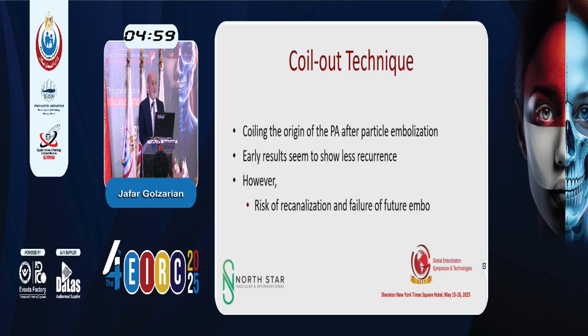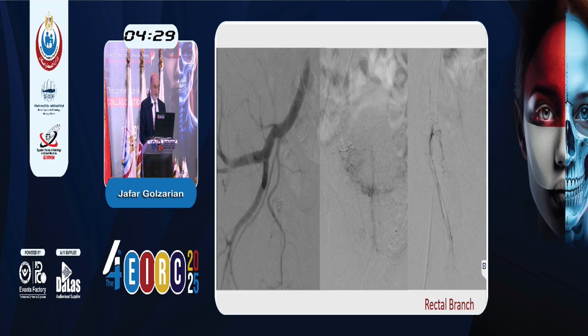The coil-out technique was proposed by Ari Fishman, and we started to do that at the university, and the goal was to prevent the vessel from reopening. I don't say it's a bad thing to do, it's just you have to be very careful when you do that. You have to pack exceptionally well, because if you don't pack it, it will recanalize, the patient comes back with symptoms, and you can't get back into it. So be careful if you do that technique.